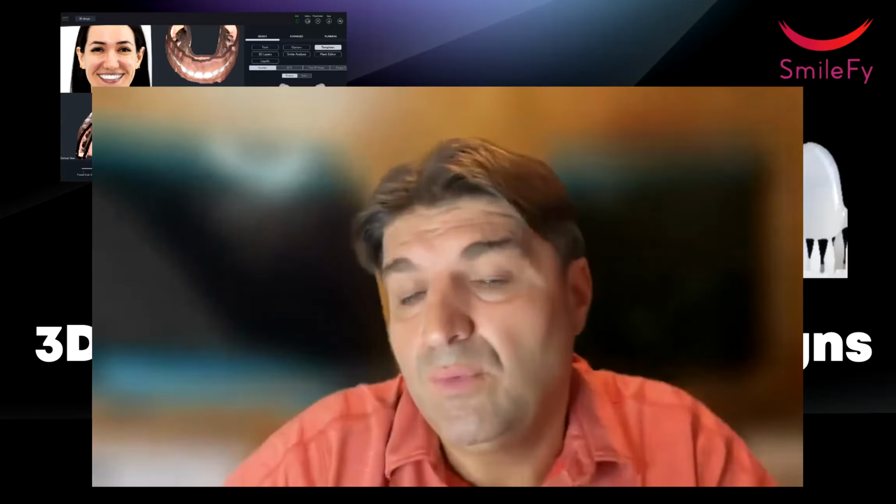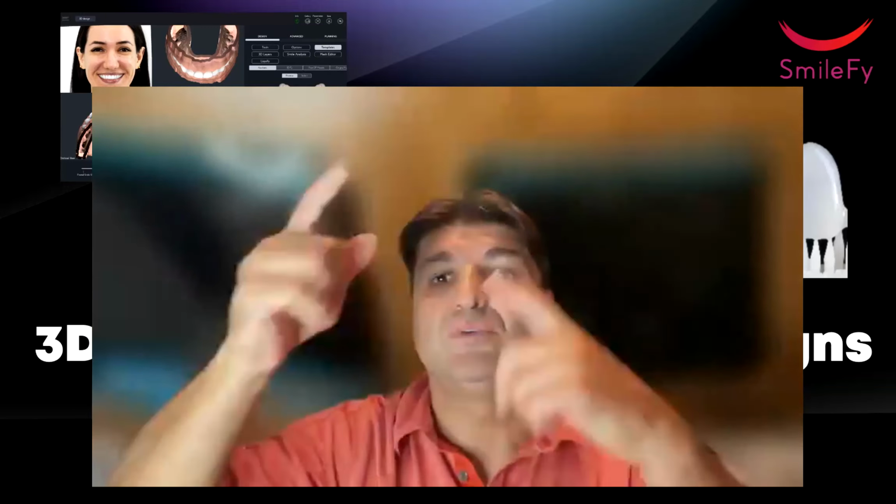So if you follow, we do have a program, and this program builds the knowledge and expertise step by step. If you start, for example, with the simple mockup, then you gain all the knowledge that you need for the 3D design, and then the veneers are just an additional step. If you are designing already with other tools, then you just need to know the workflow that is top left, and then you follow this workflow to create the veneers.